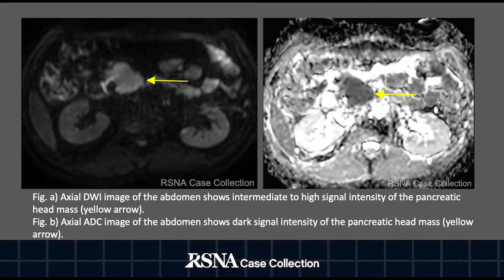Figure A: axial DWI image of the abdomen shows intermediate to high signal intensity of the pancreatic head mass, indicated by the yellow arrow. Figure B: axial ADC image of the abdomen shows dark signal intensity of the pancreatic head mass, indicated by the yellow arrow.